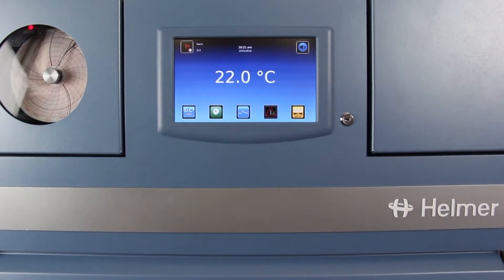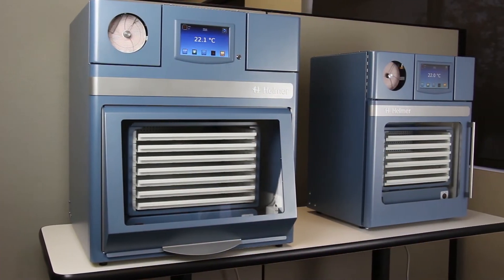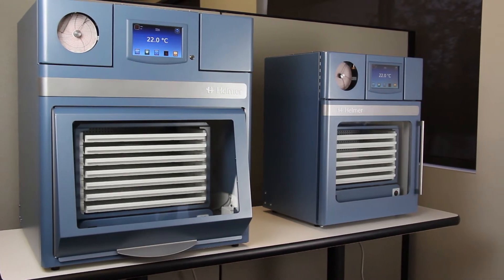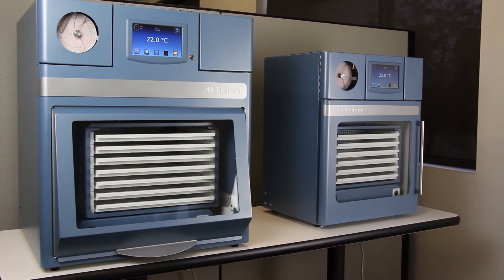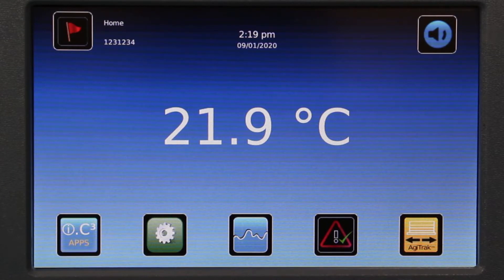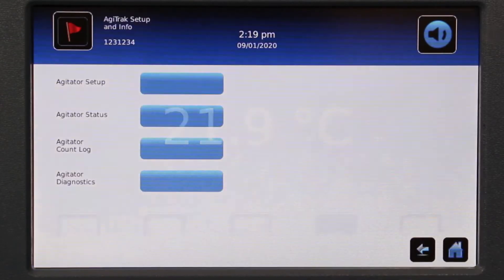This video of the IC3 Information Center demonstrates the Agitrac monitoring system that is integrated into ProLine platelet incubators. Agitrac provides monitoring for an installed agitator.